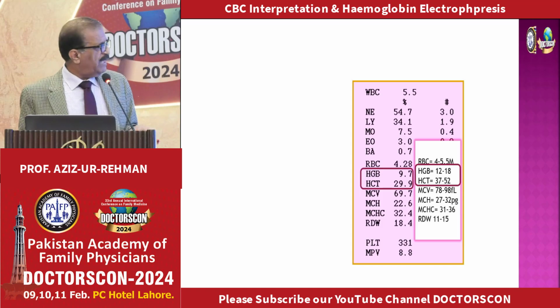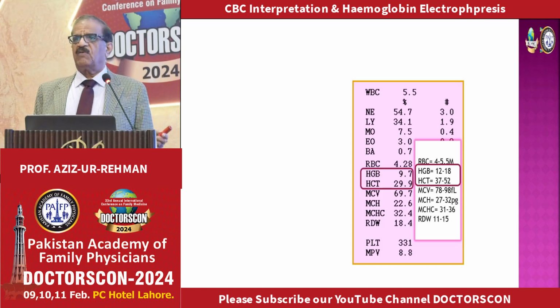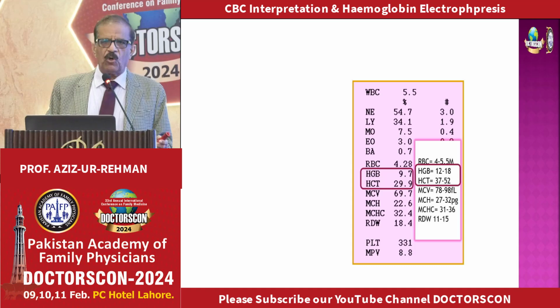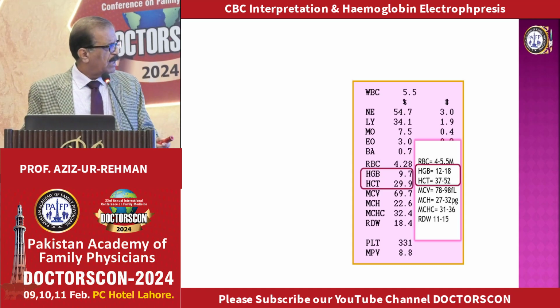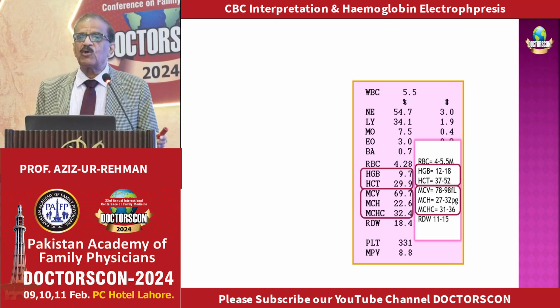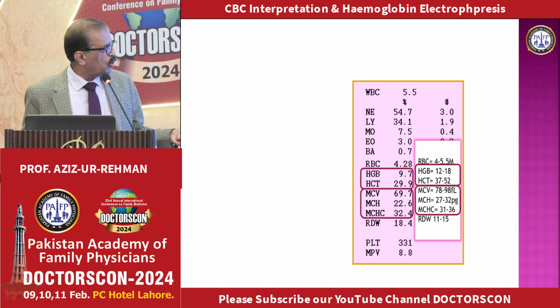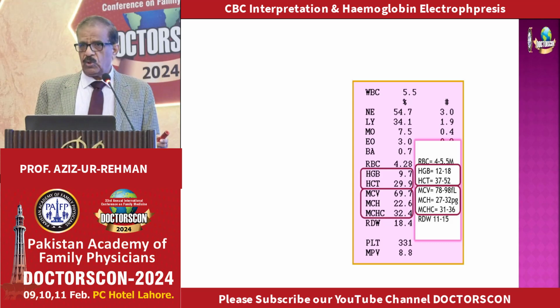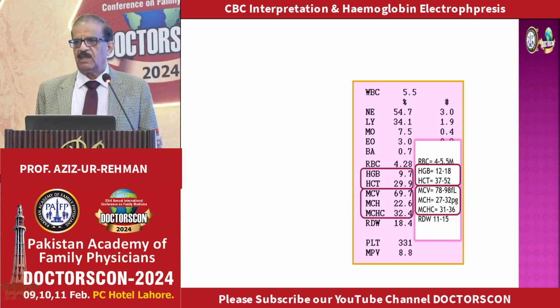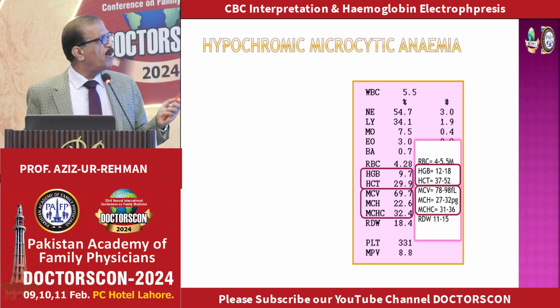So first step, HB, hematocrit. In this case, it is what? Low. HB is low, hematocrit is low. So one thing we are sure of is that this patient has anemia. As a second step, we'll see this one. MCV is low, so this patient has microcytosis. MCH is also low, so it has hypochromia. At this moment we can just ignore this MCHC. So I think we have made a diagnosis of which anemia? We have made a diagnosis of anemia here, microcytic, hypochromic. So very simple, logical, hypochromic microcytic anemia.